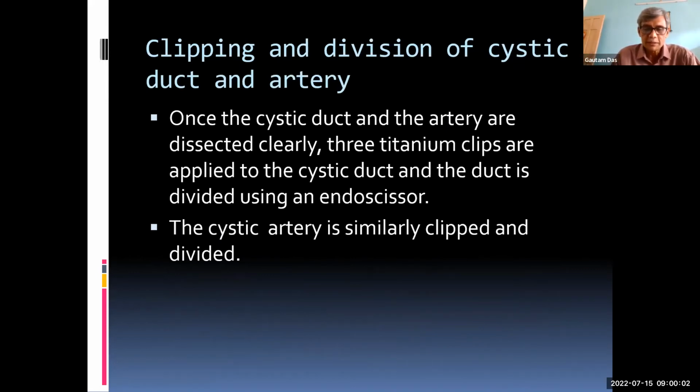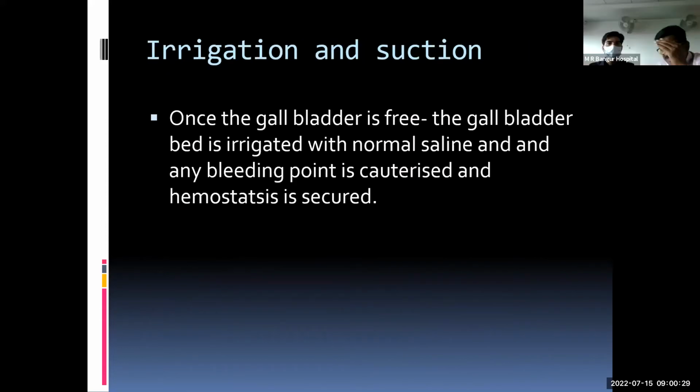So actually, there is a question whether we will clip the cystic artery or the cystic duct first. There is no standard dictum in laparoscopic cholecystectomy, but in many situations, the cystic duct may be straightened if you clip and cut the cystic artery first. You can get a longer cystic duct to clip. You can see it better. The dictum is artery first and then the duct. Yes.